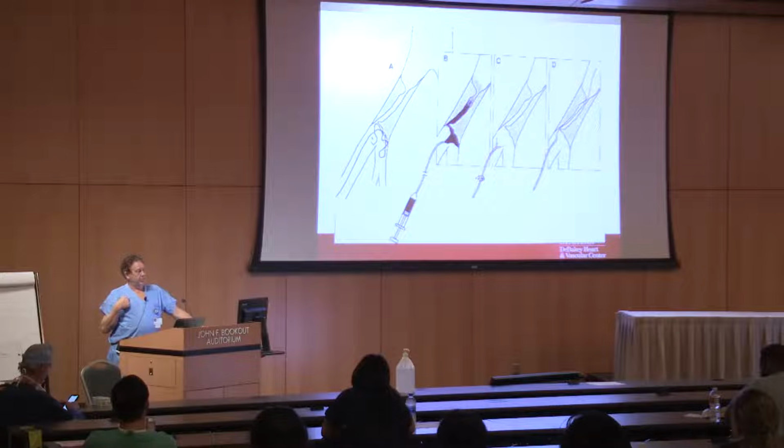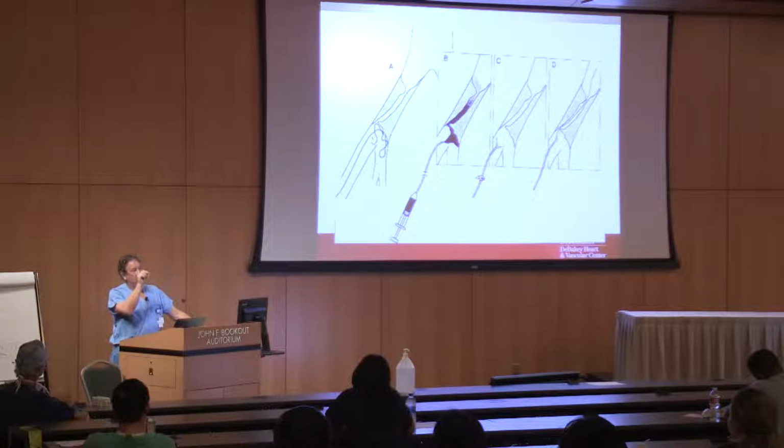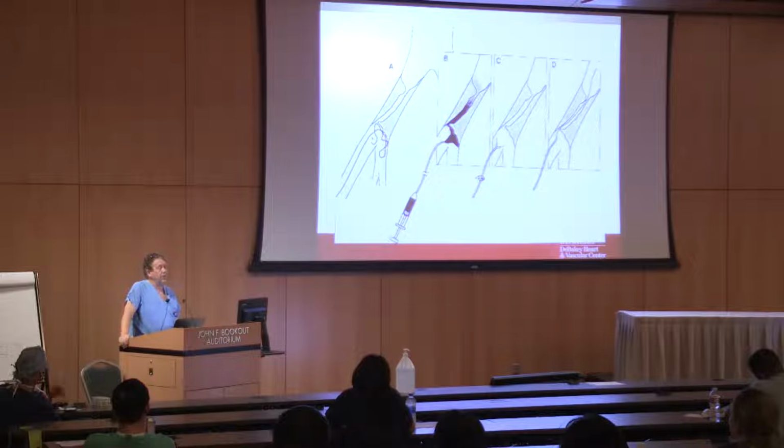Another situation that arises is if you've got an innominate stenosis. You bring a catheter and a sheath in from the arm, and you inject dye. You can see the distal end of the stenosis pretty well. But because there's a stenosis, you get this little trickle of dye that comes down through it. It hits this massive aortic flow, and you can't see where the inside of the aorta is. And in order to stent a lesion accurately, you have to know both sides. You need to know upstream, you need to know downstream.